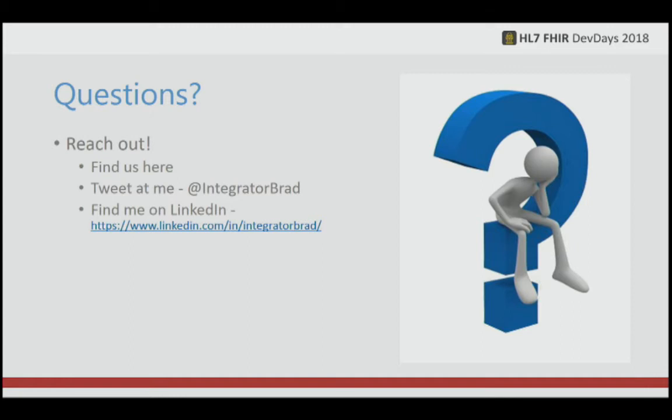Any other questions? Yeah. Is there any specification defined, if someone wants to pull an image, for the hardware and the software, what do you need to do? So, for example, a mobile phone or a server for Windows and Linux, is there a specification defined in there? To an extent. So clients can define what they want to ask for. So if they want to ask for a small file, they're able to. If the client happens to be fully capable of rendering DICOM and is really DICOM imaging based, then it will be able to ask for that. So really the onus is on the client to define what it actually wants to do.